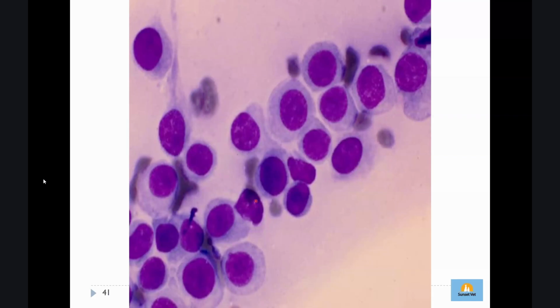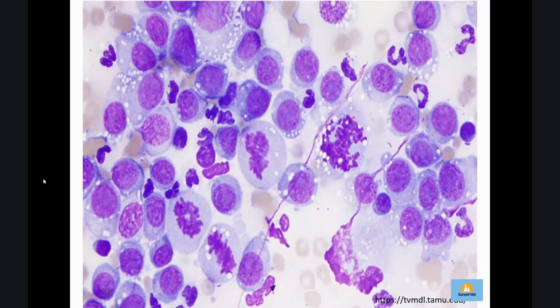So do you think the nucleus is in the center or more to the margin, or more eccentric? The margin. Yes, on the center, right? It's more on the center here. And the nucleus size is also not that big. So this one is beautiful also. This is typically the histiocytoma. And how about this one?